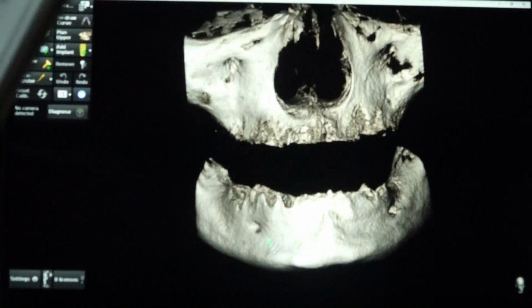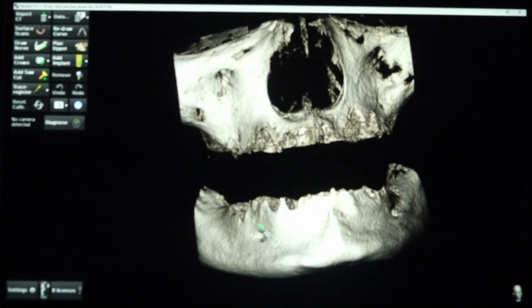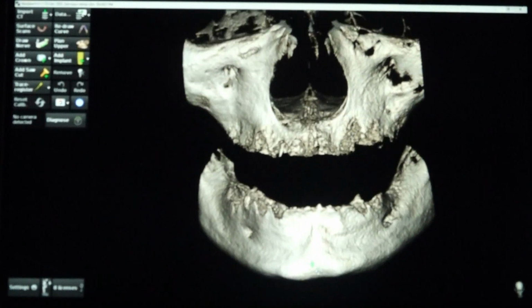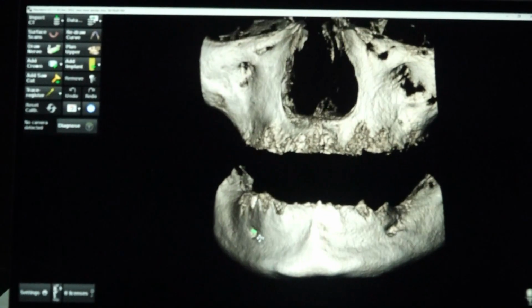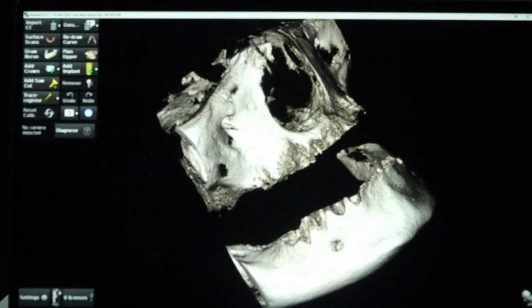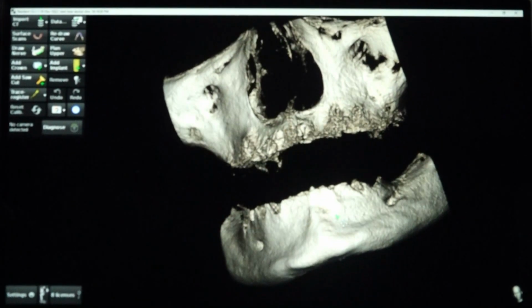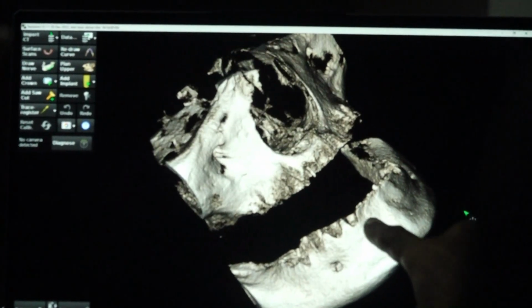We are planning for full mouth implant for this patient. First we plan for mandible. So what is the basic guideline to consider before going for full mouth implant in mandible? We will discuss now. First planning is how much alveoloplasty is needed, and where to do the alveoloplasty. Most of the time, anteriorly there will be a supraeruption along with the alveolus.